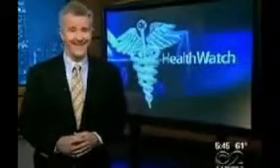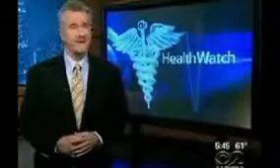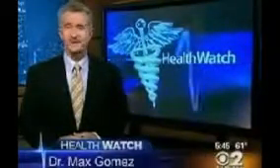This system is not just safer for the patient because the doctor can steer by remote control in a separate room. He or she is exposed to much less radiation, minimizing the chance of developing cancer from years of x-rays. Dr. Max Gomez, CBS 2 News.